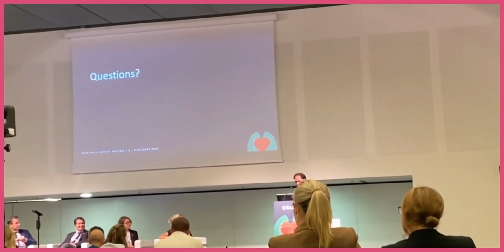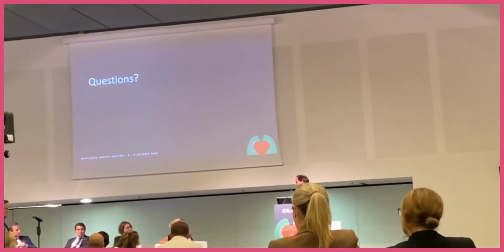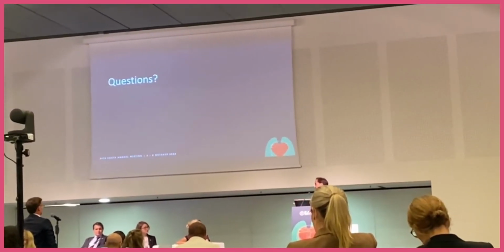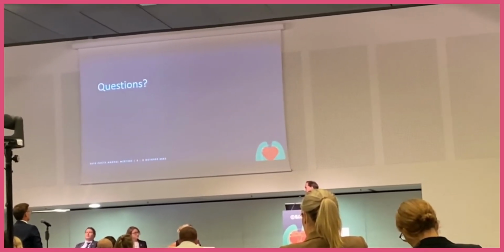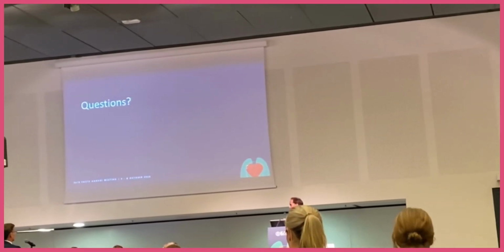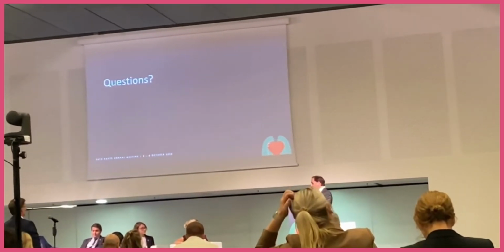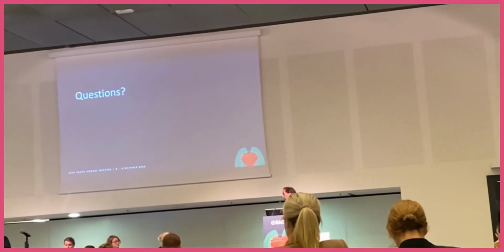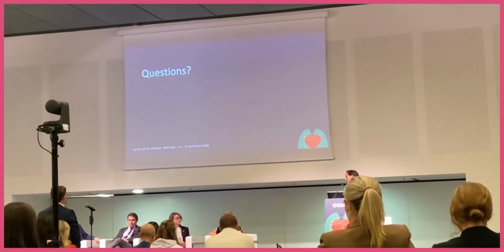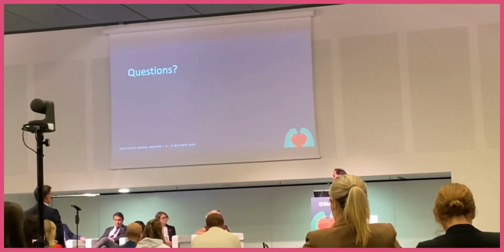So to answer the first question, the pulsatility index is between 1 and 3. So the highest pulsatility index we had was 3, the lowest we had was 1. So all pulsatility indexes were normal and way below 5. And we're talking diagonal vessels, so 16 milliliters. To give a clear idea, we do this procedure on pump. So we start the procedure on pump, negative flow in the target. So we construct all the hand-sewn grafts on clamp, then we unclamp, still on bypass, we construct the ELANA Heart target on the diagonal. So I think these 16 milliliters are during pump, but not off pump. So we probably get underestimated flow.